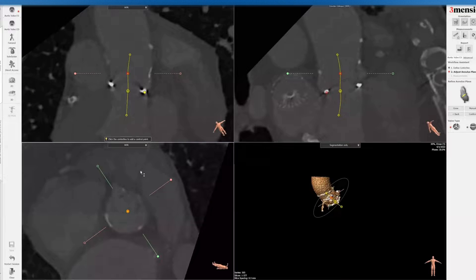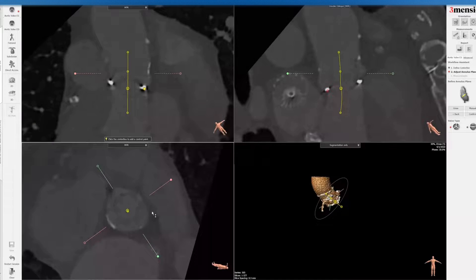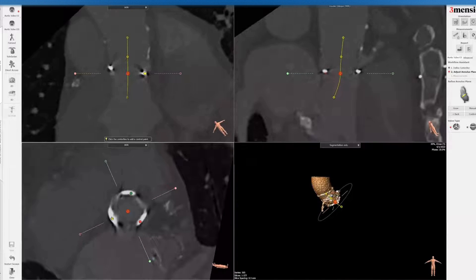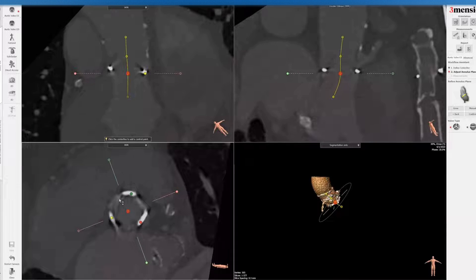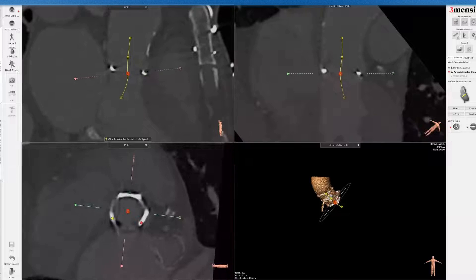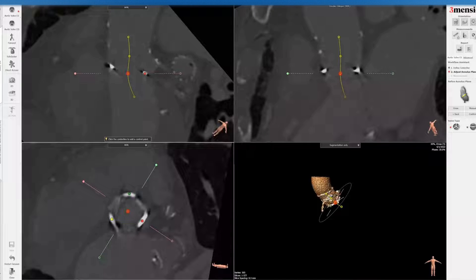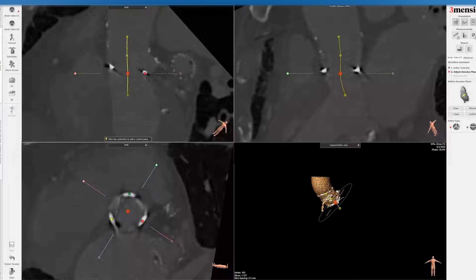This can be very tricky with the Mitroflow valve because you don't see the commissural posts. So you want to roughly get as centered as possible with the valve frame itself. I'm looking at the non-sinus and coming down to the base — remember this is a wavy line so it might not be perfect. Then placing the green dot at the base of the right sinus, and again at the base of the left sinus, while keeping the center line as centered as possible.